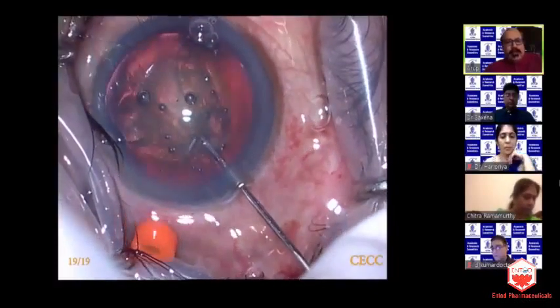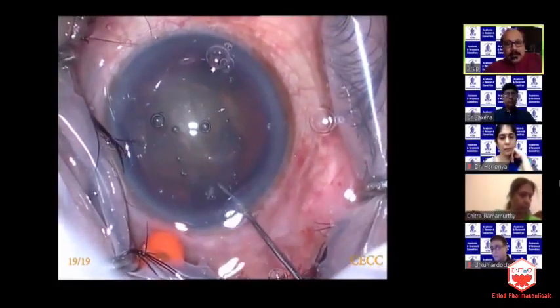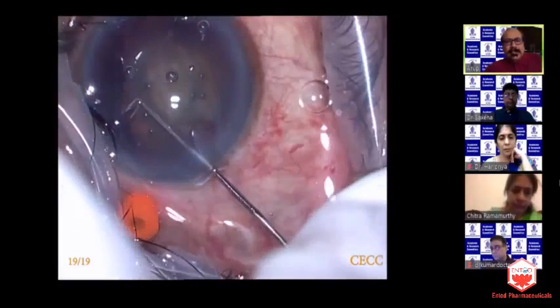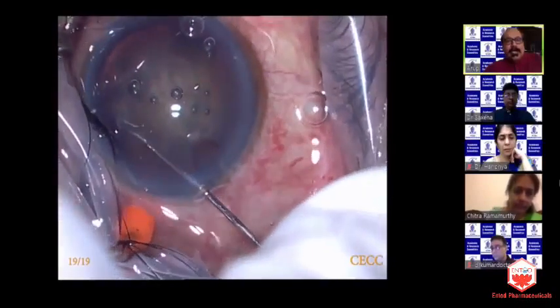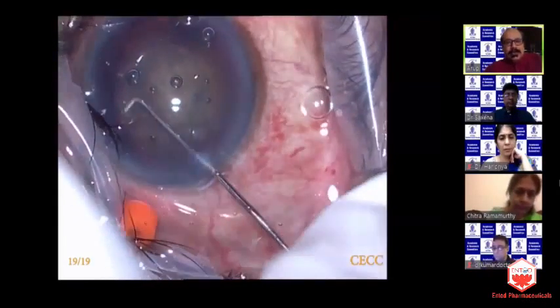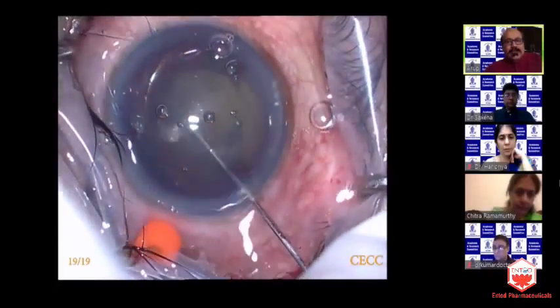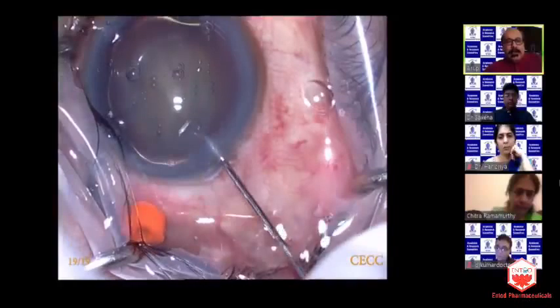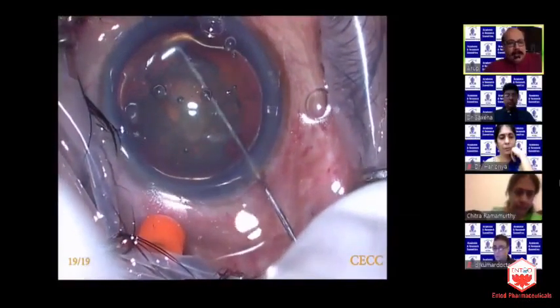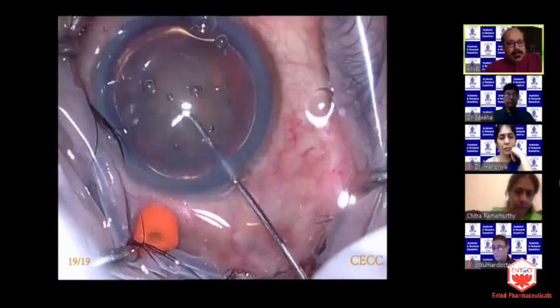Obviously no, because we have a very good red reflex, and there is no dulling of the reflex. The patient doesn't complain of any pain. If you have the minimal suspicion of a suprachoroidal hemorrhage, it is mandatory that you don't proceed with the cataract surgery. Close the incision and refer the patient to the posterior segment surgeon, who will take up the patient after a couple of weeks when the suprachoroidal heme liquefies, and that is the time when you can complete the cataract surgery. So definitely it was not a patient with suprachoroidal hemorrhage.